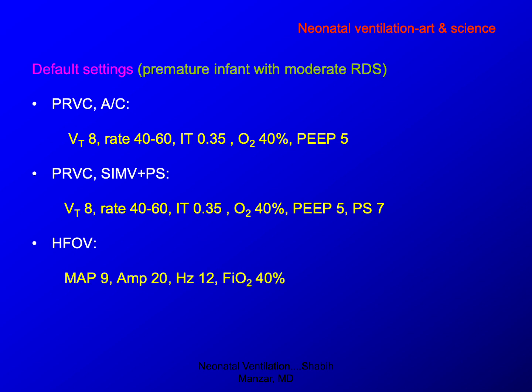And for high frequency ventilation, the settings are different, and this is not the talk about that. And for the jet, again, we have some YouTube videos on jet. If you Google our Neonatal and ICU, you will find 5 or 6 presentations already on the high frequency jet ventilator. Now case 2. So this is the follow-up gas, 7.18.